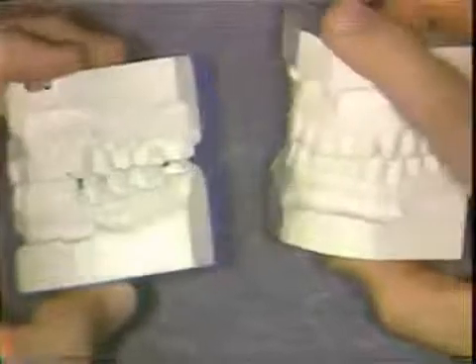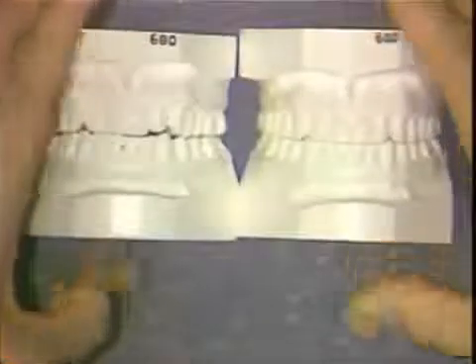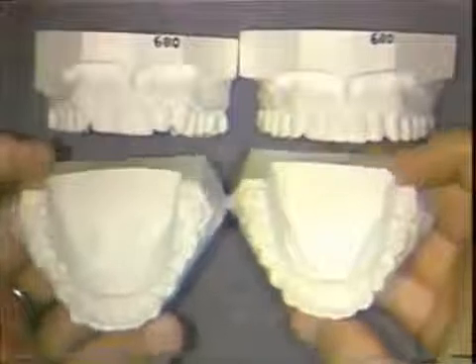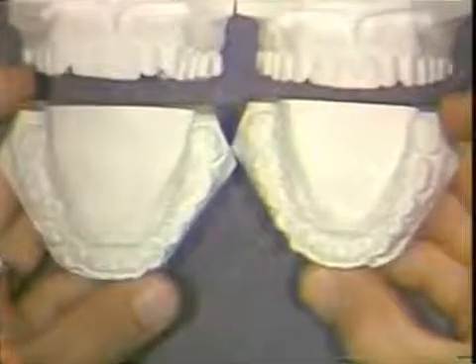This is the finished result, and you can see the proper interdigitation has been achieved both right and left. And in this instance, the lingual arch was used as a way of constricting or narrowing the lower first molars.